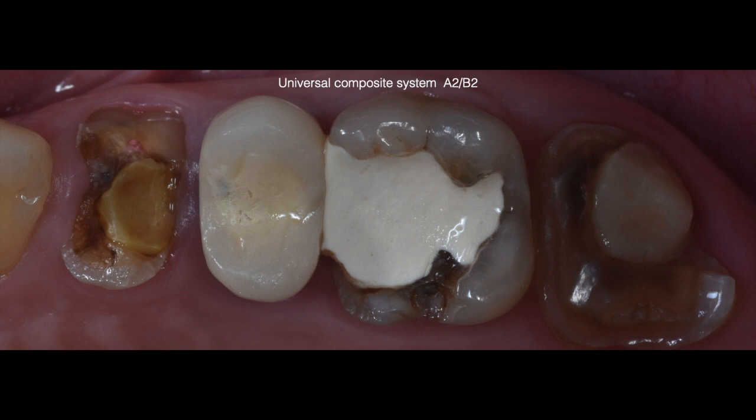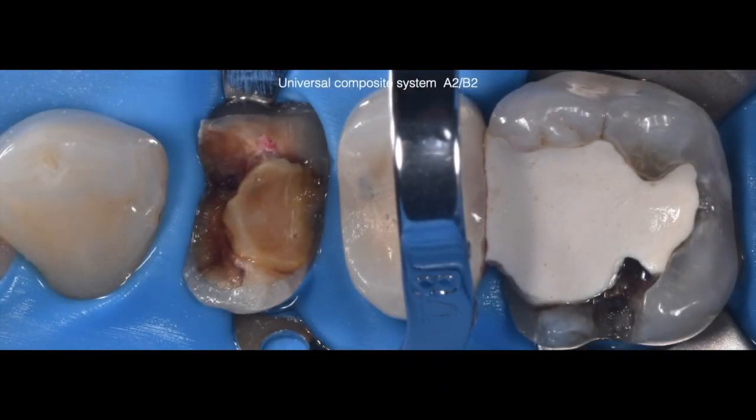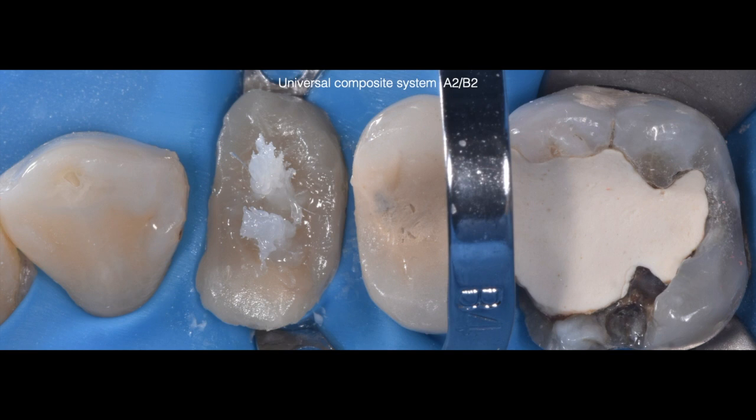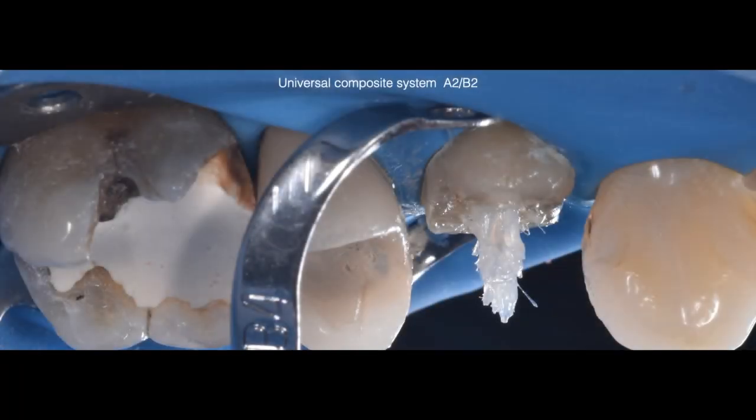As you can see, tooth number 12 has fractured off to the gum line, and there is a large temporary restoration on tooth number 14 that we are going to restore using Brilliant EverGlow A2B2. Ideal rubber dam isolation was achieved. After caries removal and cleaning of the substrate, a total etch technique was used in combination with 1-coat-7 universal. Deep margin elevation completed, and 2 braided fibers were packed into the canal orifices. Here is a lateral view of the fibers.